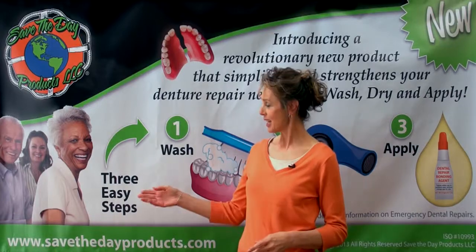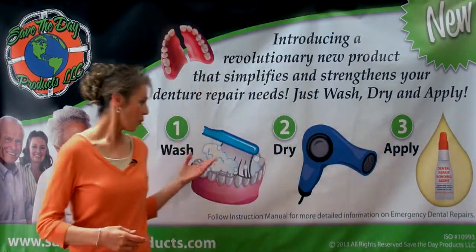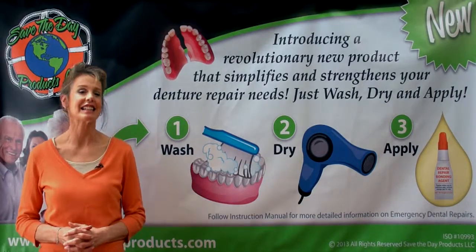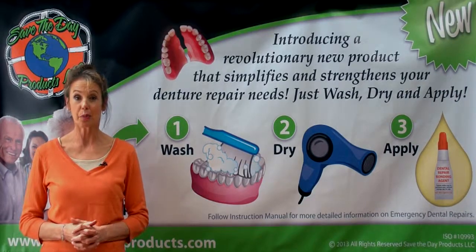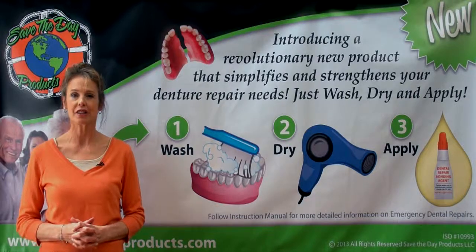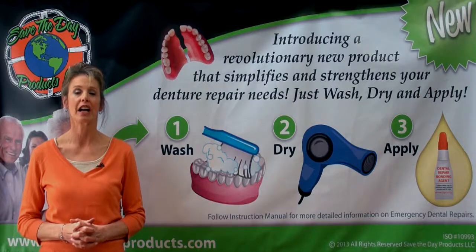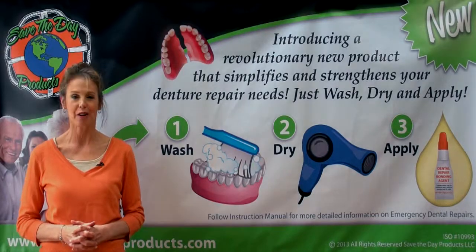There are just three easy steps: wash, dry, and apply. There's no mixing, no messes. It's clean, and it's safe. All orders are supported by a website with dozens of illustrations of denture repairs. In a follow-along tutorial, you are shown how to fix any dental appliance, no matter where you are.